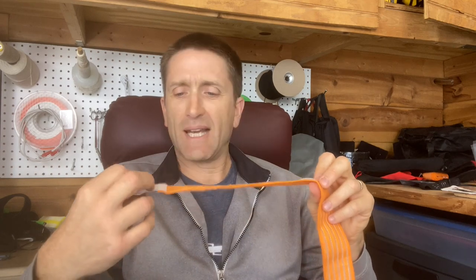But, you know, let's go through some of the other variables. What do you put on the label here? Application time? What about reassessment time? And that could be a useful thing. And then the tabs themselves. So there are four tabs on here. They're rectangular. Would squares be better? Would it be better to go with three or five tabs or zero?